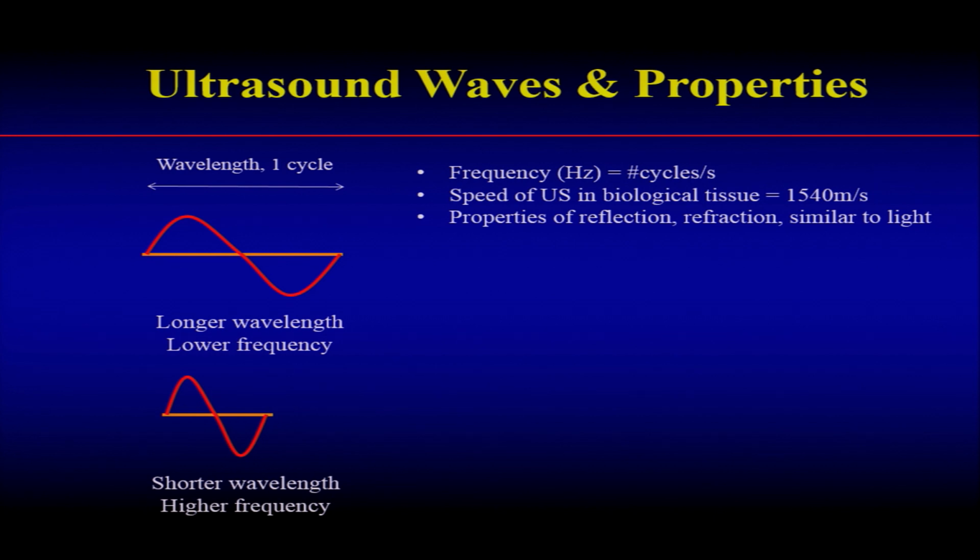A wavelength is one cycle, and the frequency is the number of cycles occurring per second, and the unit is hertz, after the physicist Hertz. And so the longer the wavelength, obviously the lower the frequency, and the shorter the wavelength, the higher the frequency.